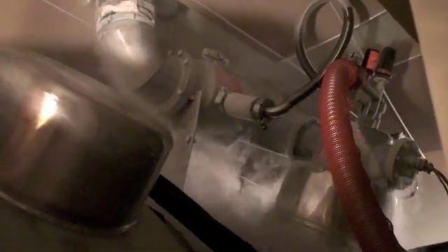It's liquid oxygen, liquid nitrogen. It just got cold enough to actually, yeah, it's liquefying on the steel. It's actually liquefying on the steel. You can hear it, it sounds hot. It sounds like it's popping. Oh, yeah, that's liquefied air. Right, it's all coming down. And yeah, you'd burn yourself big time if you get near that. Yeah, you'd burn yourself big time.